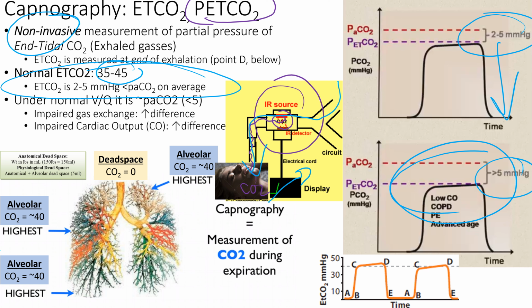Maybe we get an ABG to change the vent settings. Maybe the tidal volume or rate is too low or high, do you think, on the ventilator if I'm getting my CO2 climbing up on the monitor? Too low. It's too low, right? So we have to get those changed.